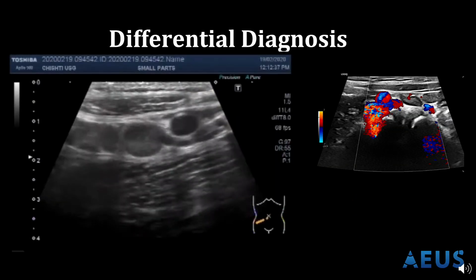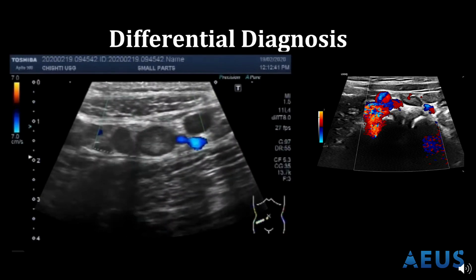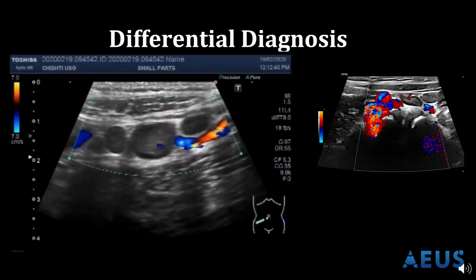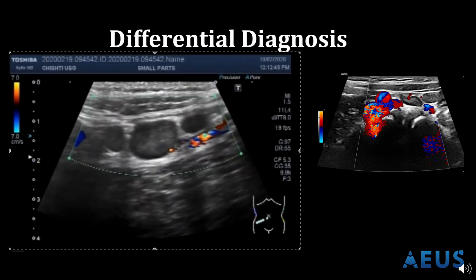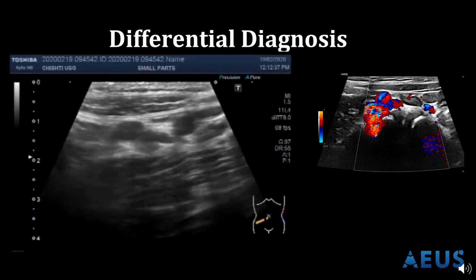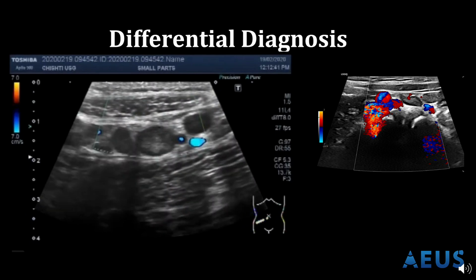All right, let's talk about some other differential diagnoses of right lower quadrant pain. So here you can see some enlarged round structures, and when you put some flow in it, you will clearly notice that these are lymph nodes. Mesenteric lymphadenitis is the second most common cause of right lower quadrant pain in the pediatric population and should also be on the differential.